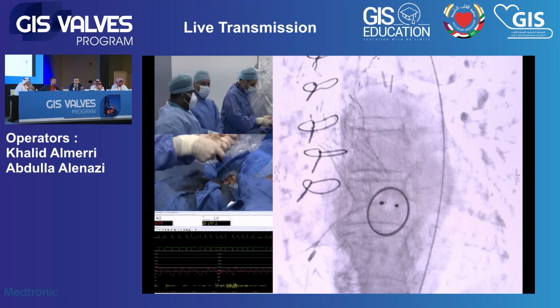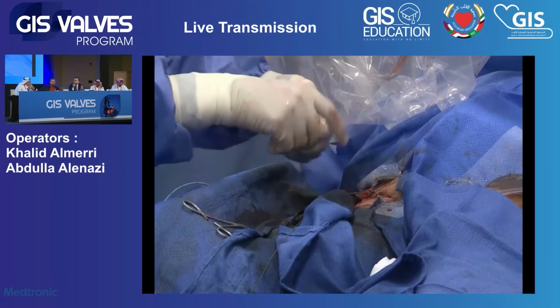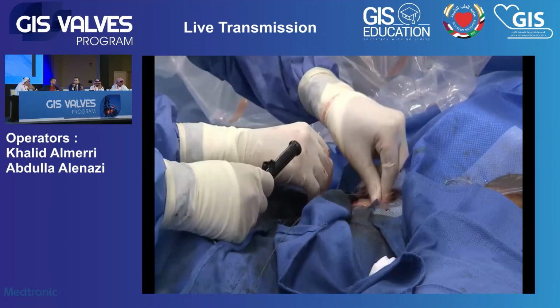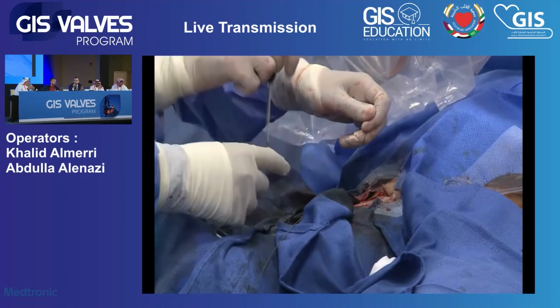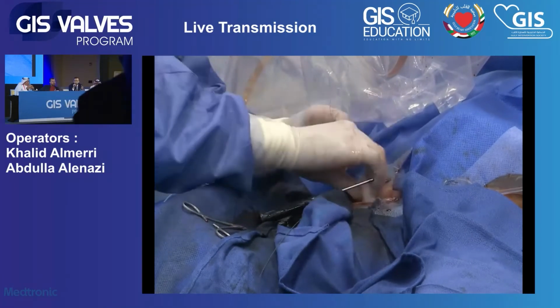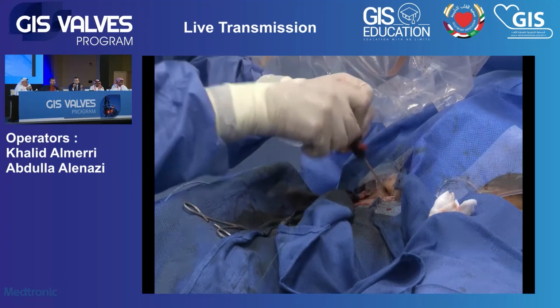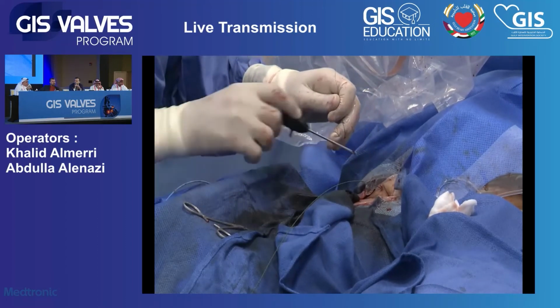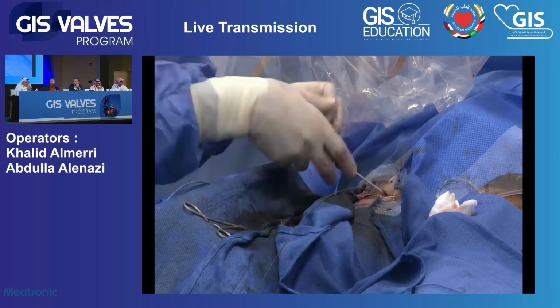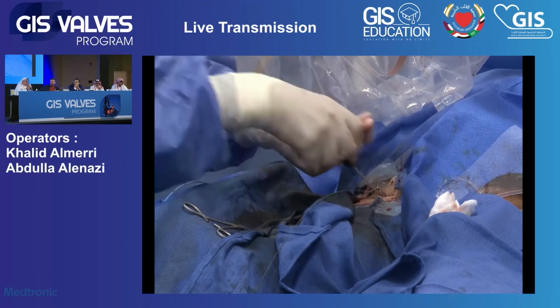Because once we start deploying TAVI, which we will be in young patients, I think the longevity of the valve will rely on the paravalvular leak, or on how much perfection we aim for during the procedure. For this particular patient, I think that doesn't apply. However, for future reference, devices to debulk the valve prior to deploying the TAVI device become more significant. I'm sure we are coming across so many new technologies. I have seen that new technology recently, and it's really about debulking. We need some more data, certainly.